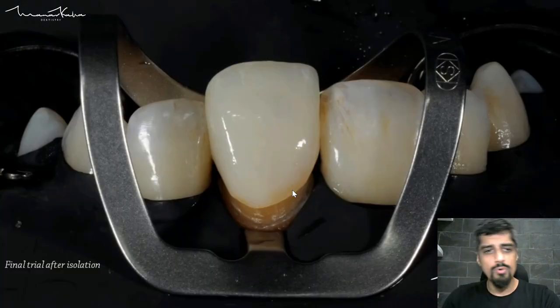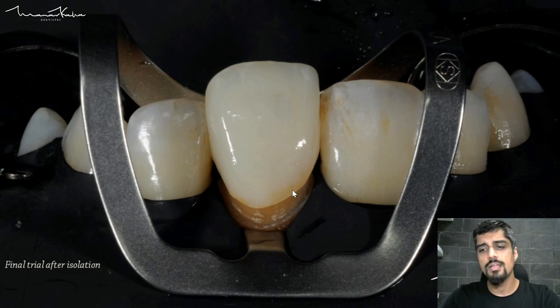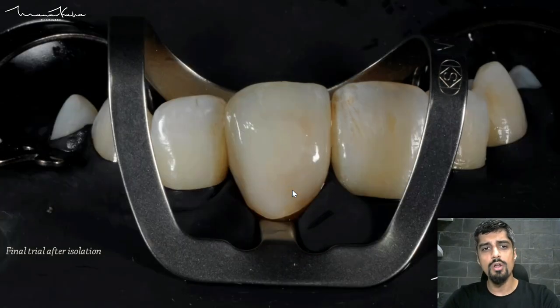This is the isolation and drying. Once you put the rubber dam, you also need to do another trial so that after the rubber dam has been placed and the clamps are in place, the crown is seating to its final place. If you're not using rubber dam, then the trial at this point is obviously not needed.